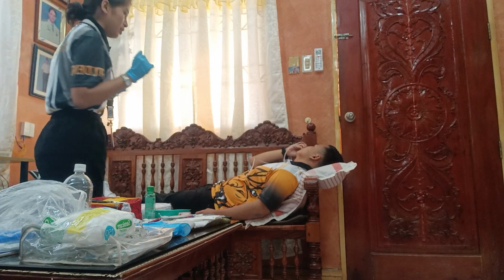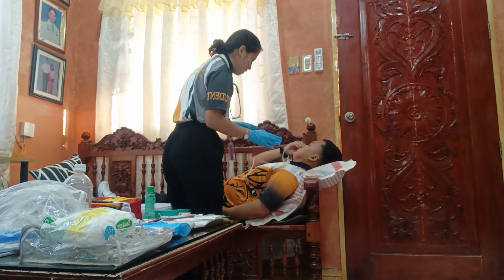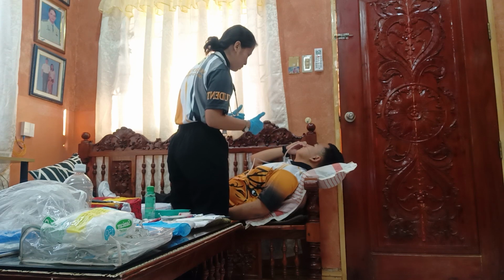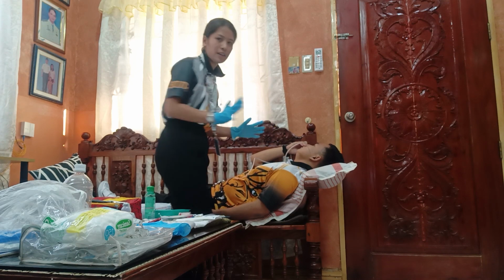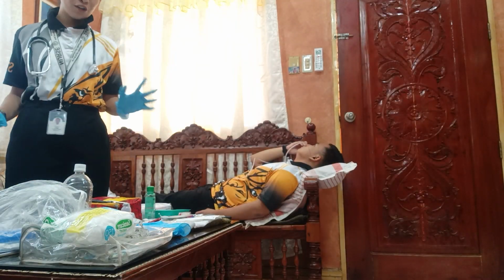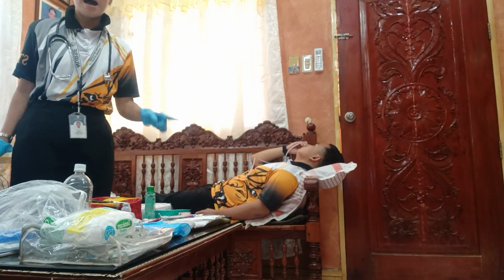and another is. Sir, pwede po ba kayo magsalita or mag-hum? Hindi naman po sir masakit. Hindi naman. Okay. And after that is, now po isi-secure ko po siya gamit po nitong tape.